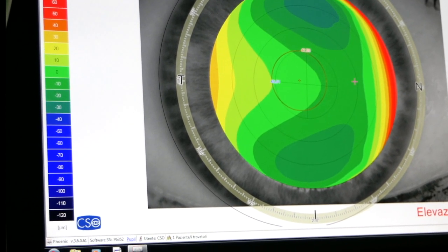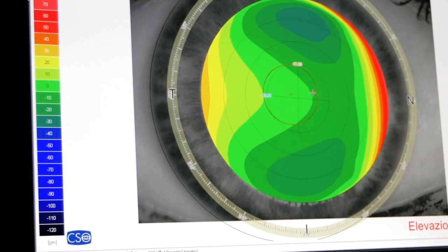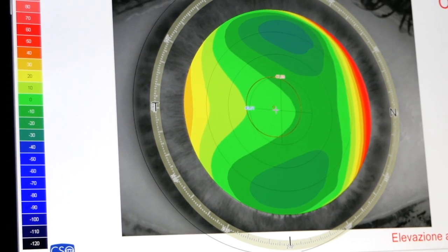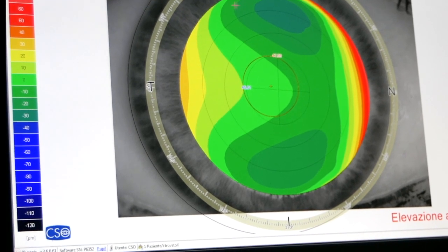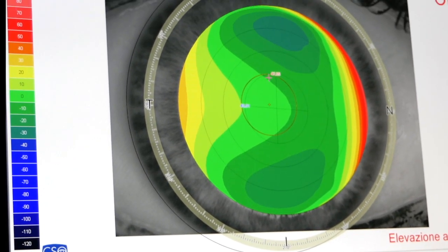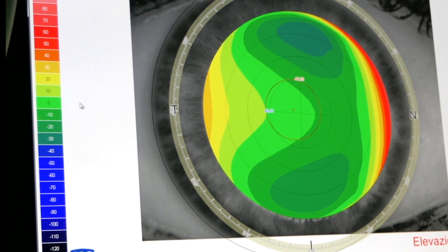We have to imagine that a computer takes the mean curvature radius of the cornea, builds an ideal sphere that represents green, which is the average of the curvature of the cornea.